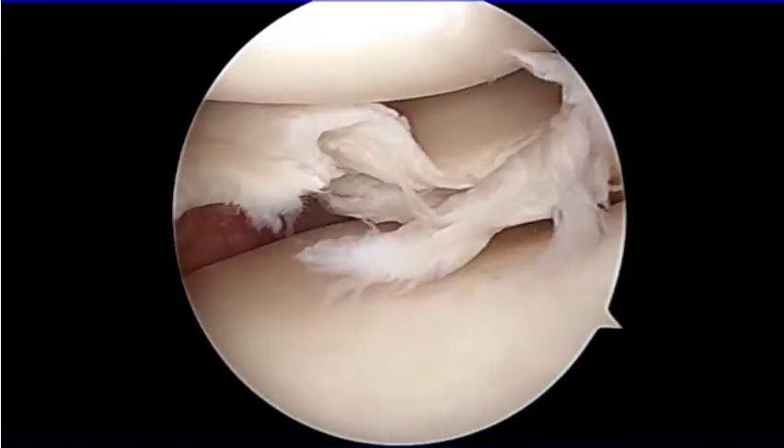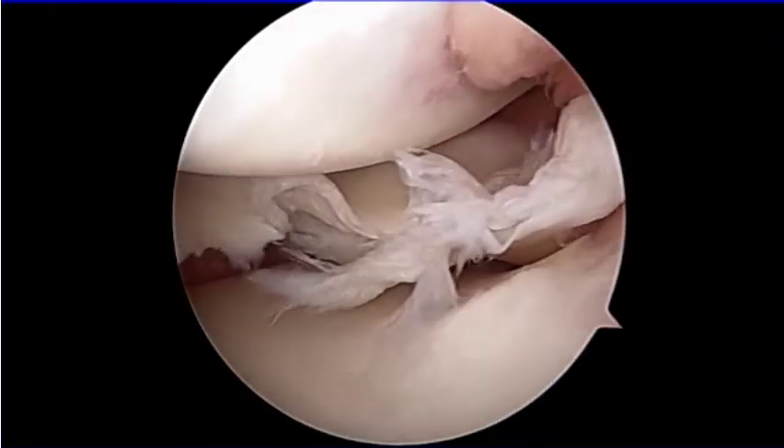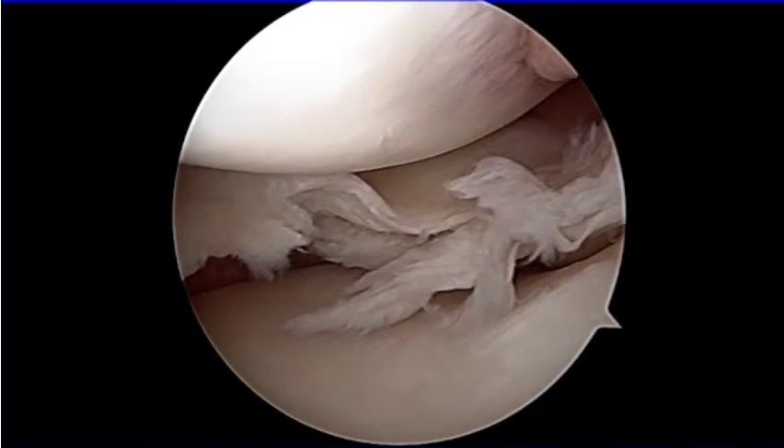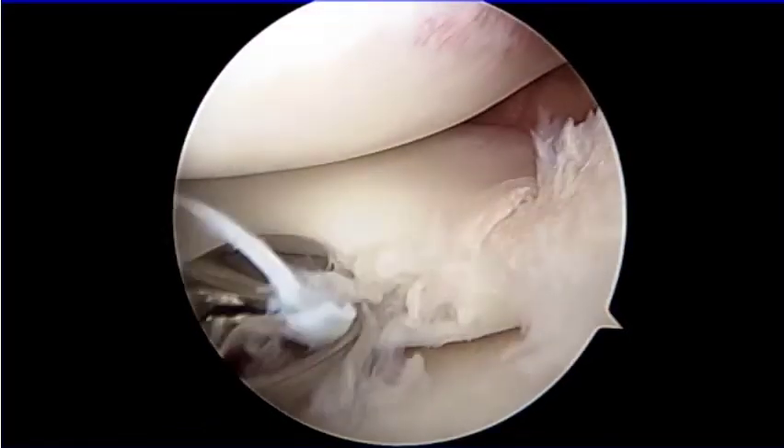This is a representative case of a meniscal complex tear combining horizontal and flap tear of the medial posterior horn of the meniscus that had already undergone degenerative changes.